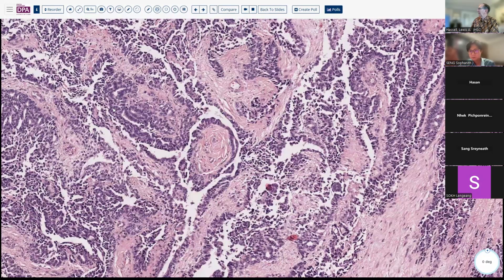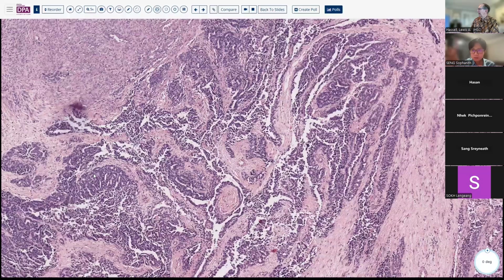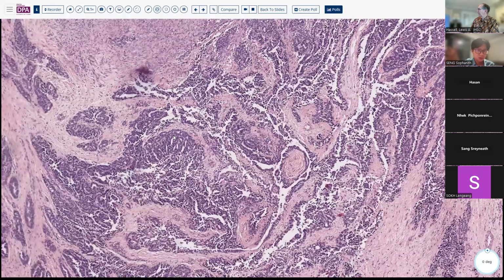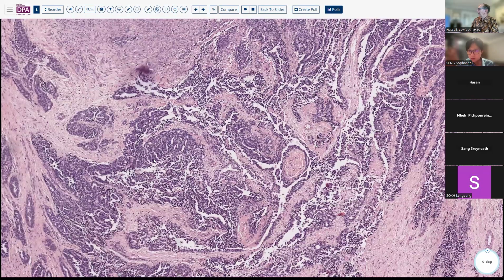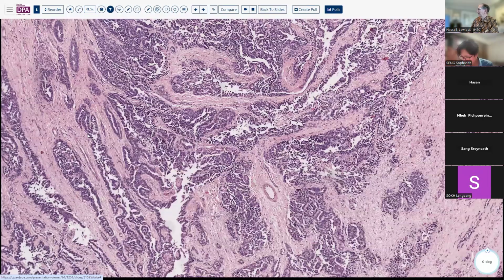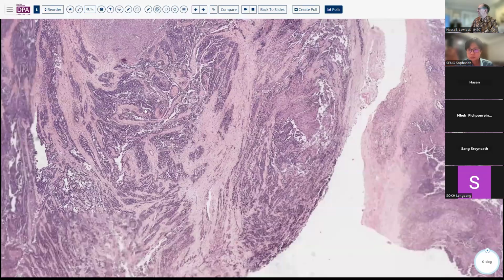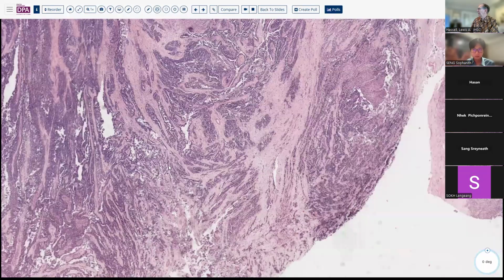This one with a predominantly epithelial or epithelioid appearance, forming these little micropapillae rounding up and invading with some slit-like spaces between the formations here. Notice these little slit-like patterns here. Very much like some of the slit-like things we see in micropapillary lesions in the GYN tract. Of course, everything has some resemblance to the GYN tract. So a nice example of epithelioid mesothelioma.